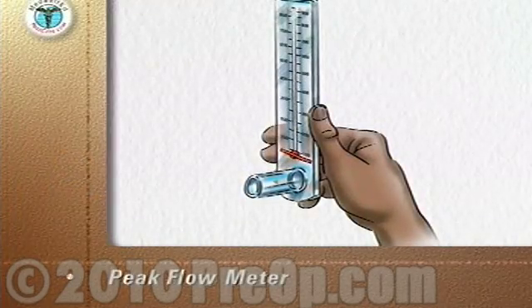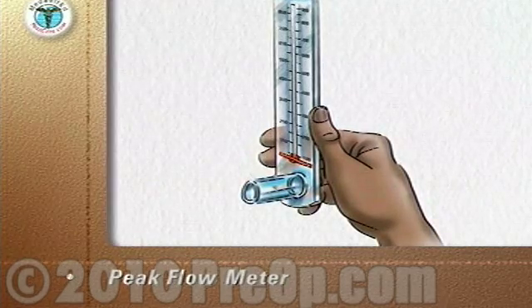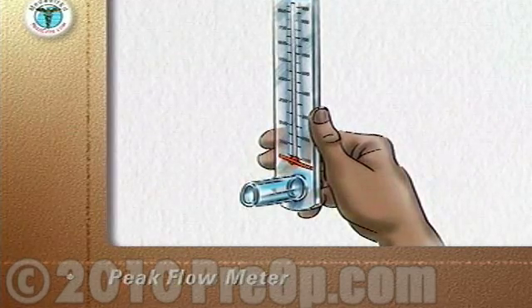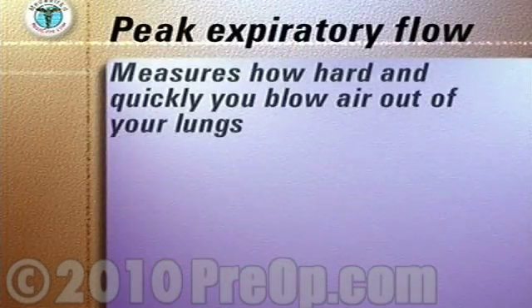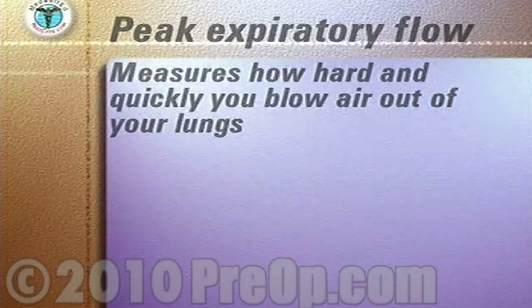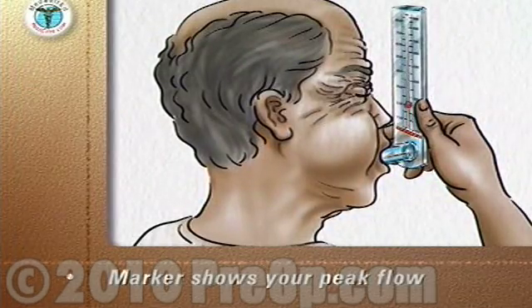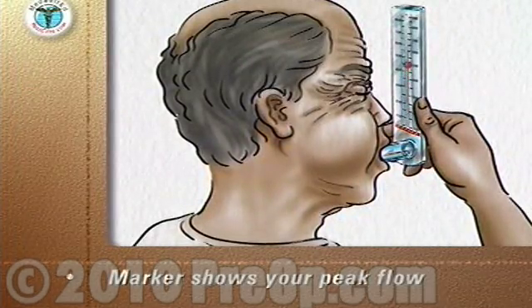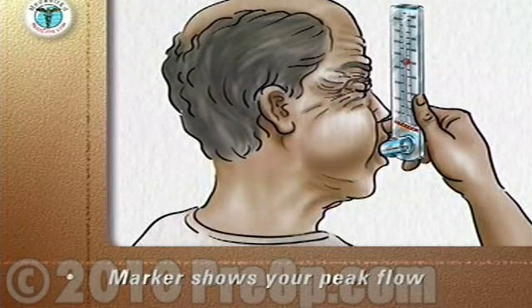A peak flow meter is an inexpensive, portable, handheld device. Your doctor or nurse will advise you which make and type to use. The device measures how hard and quickly you can blow air out of your lungs. The meter has a marker that slides up the scale as you blow out. The better your lung function, the harder you will be able to blow out, and the higher your peak flow score will be.